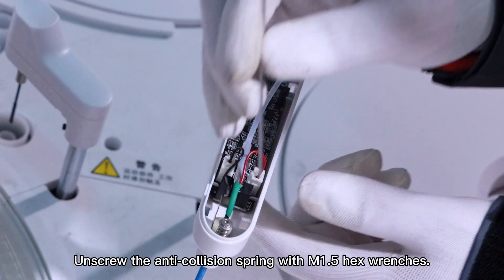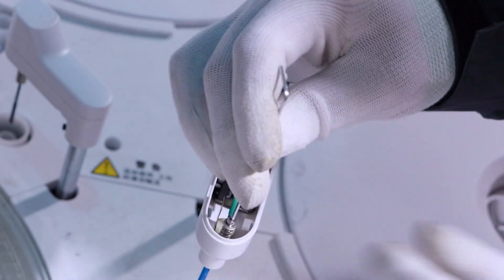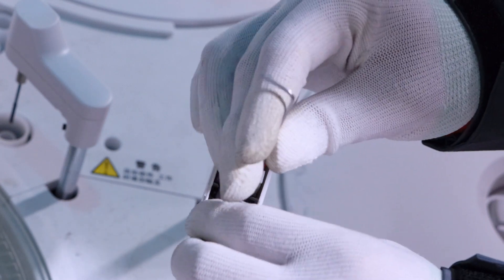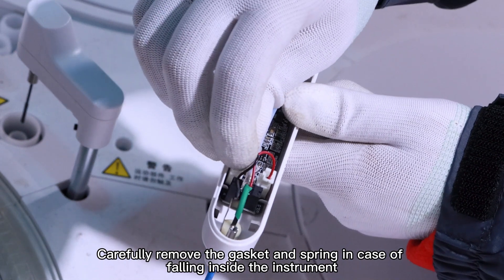Unscrew the anti-collision spring with M1.5 hex wrenches. Carefully remove the gasket and spring in case they fall inside the device.